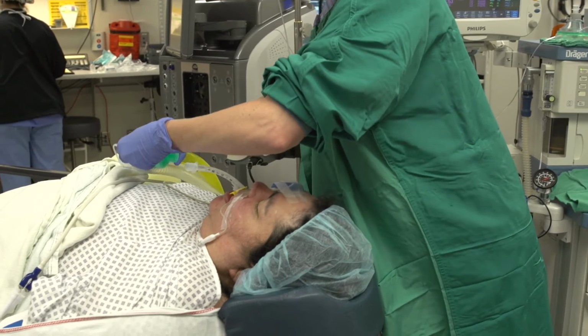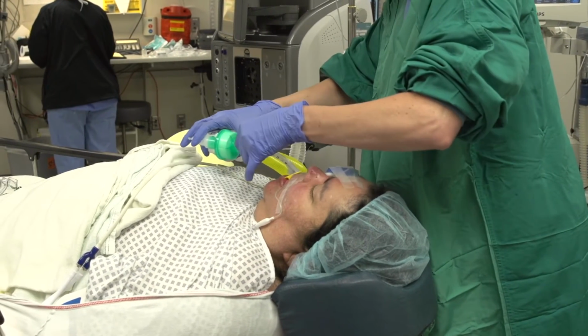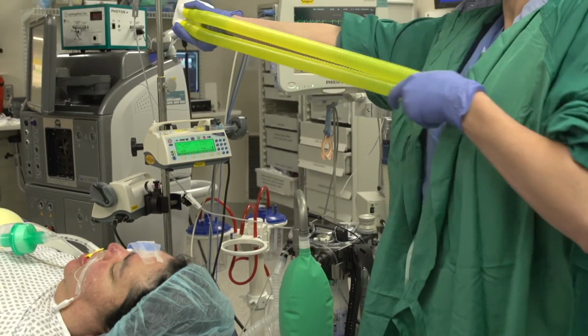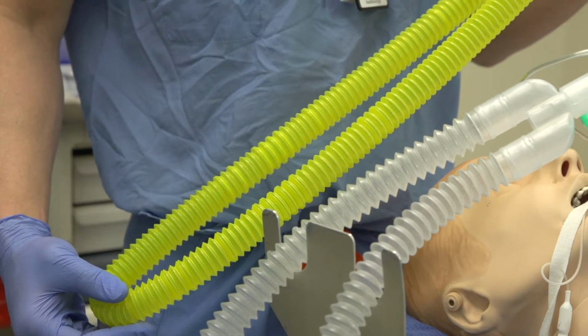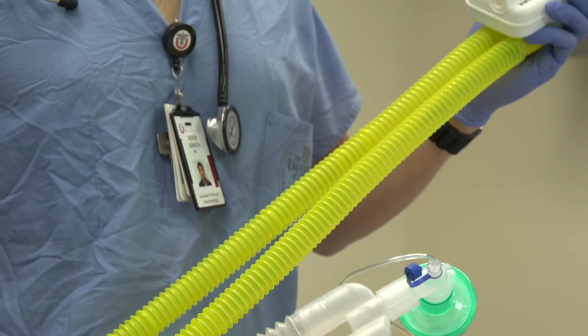Additionally, ANEclear can be inserted into the breathing circuit just preceding the start of emergence. It is recommended to fully extend the rebreathing loop before placing ANEclear into the breathing circuit to minimize the risk of inadvertently dislodging the endotracheal tube or laryngeal mask airway. Full extension of the rebreathing loop provides 750 milliliters of dead space to allow for maximum rebreathing of carbon dioxide and optimization of ANEclear benefits.